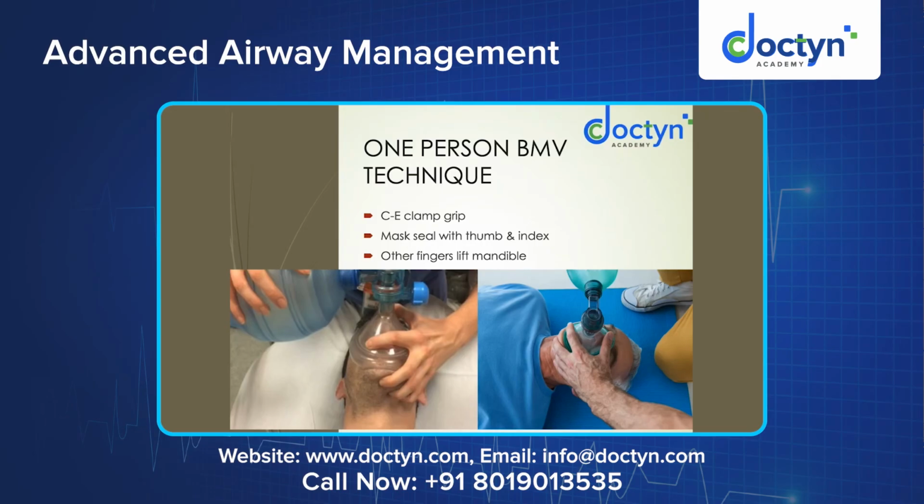While you're holding the mask, there is a clamp called the CE clamp. You can see a C is formed while holding the mask, and the E is formed by the other three fingers. With this C, the thumb is at the tip of the mask and the index finger is at the base of the mask, and this forms the seal. The mask is approximated onto the face of the patient so that the air we are giving is not leaking outside, through the place where the mask is in contact with the face. This is what the C does.